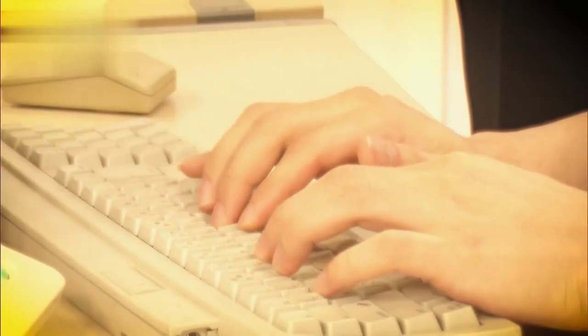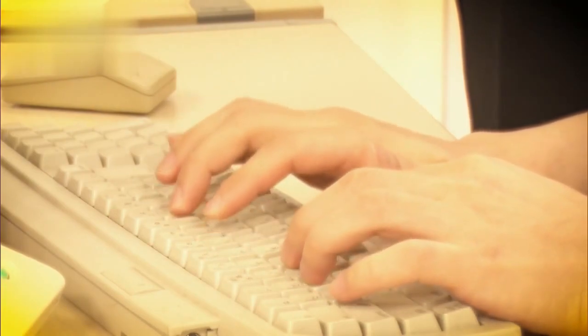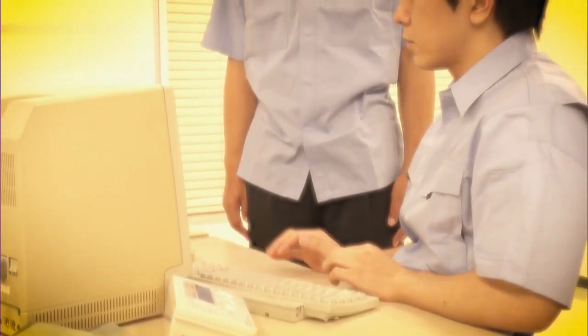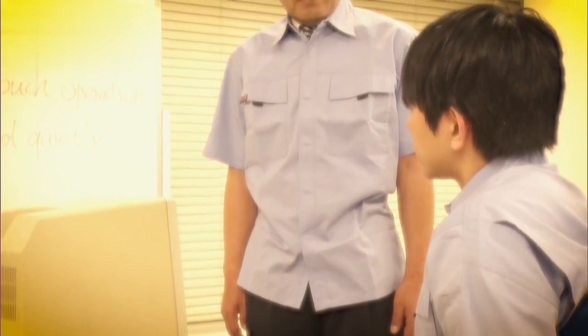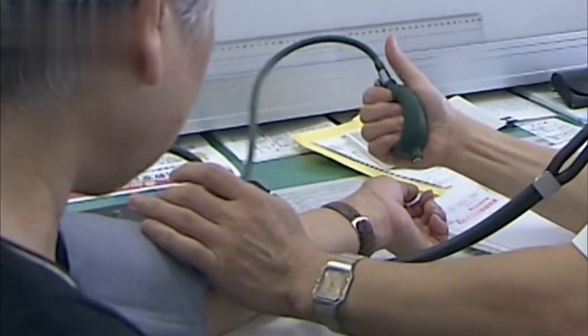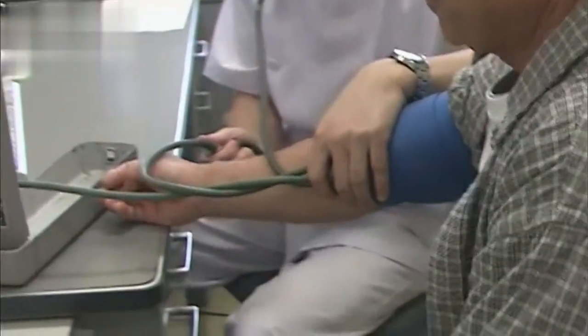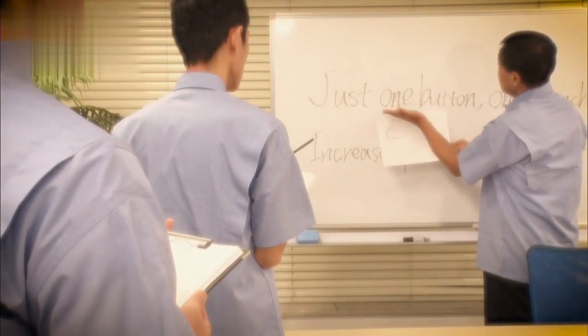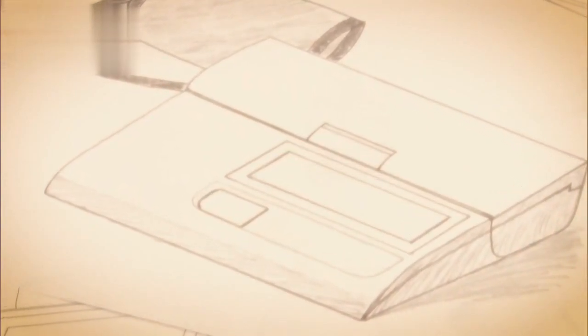The team quickly moved to implement fuzzy logic into the control program for the pump. Almost immediately, however, the big question became apparent. How exactly does one set up the special rules that will define the fuzzy logic control? Take, for example, if someone has thin arms, the air pressure should increase gently. But if someone has thick arms, the air pressure would need to increase more strongly. A machine typically operates in a binary on or off manner, zeros and ones. But by accounting for all these situations with rules, a range of operation in between can be produced.